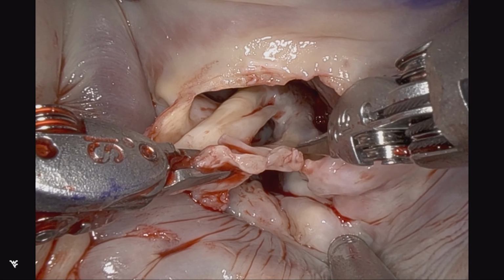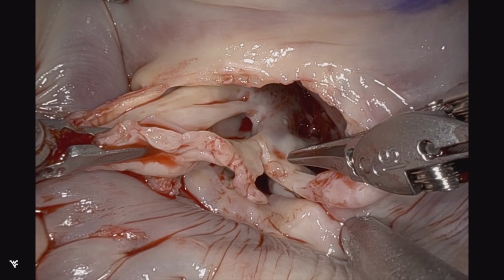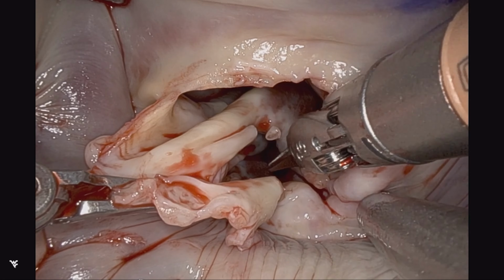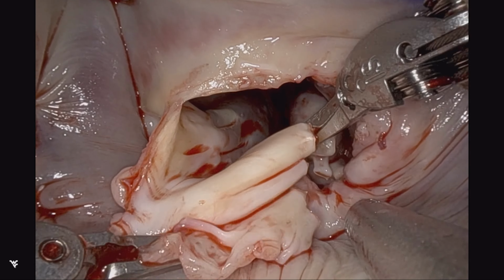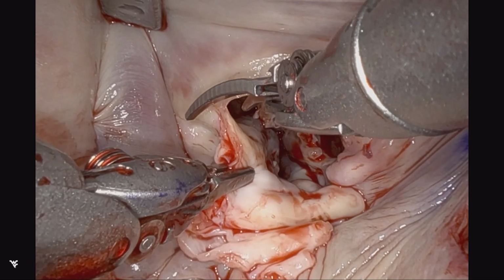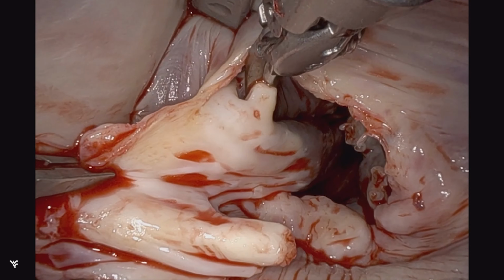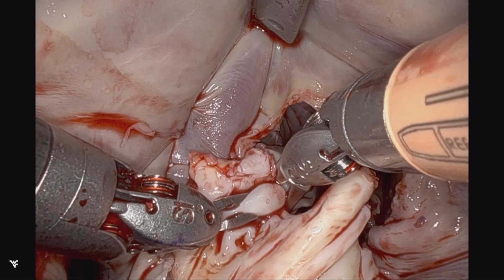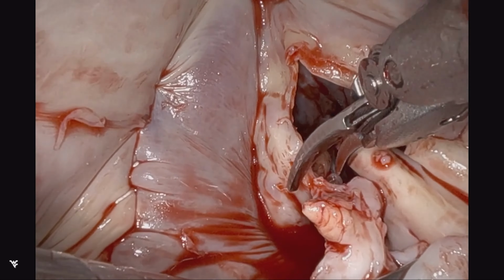You can see the valve is not large in terms of its overall circumferential size, but you can see very typical rheumatic disease with mixed stenosis and regurgitation as the pathology, but largely stenosis with very thickened cords. And this is quite typical for rheumatic valvular heart disease, as many surgeons and cardiologists that may be watching know very well.